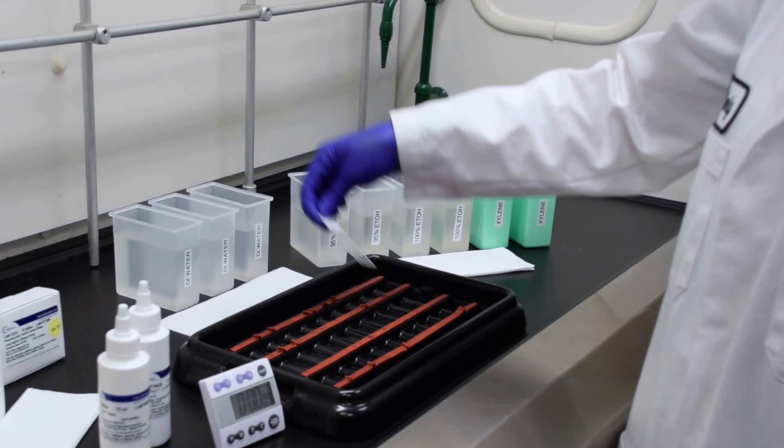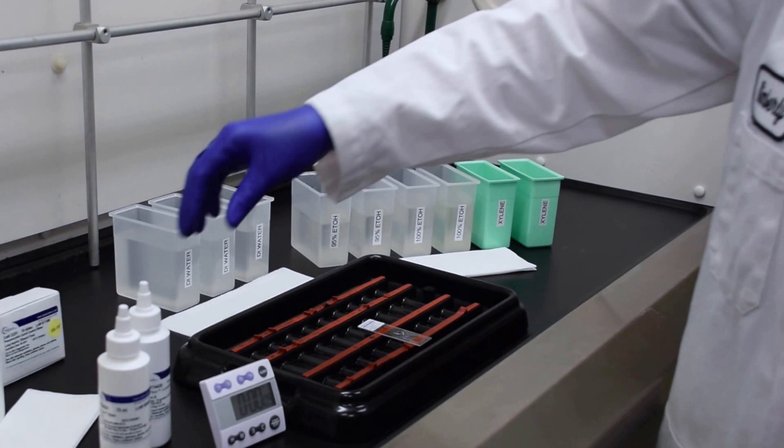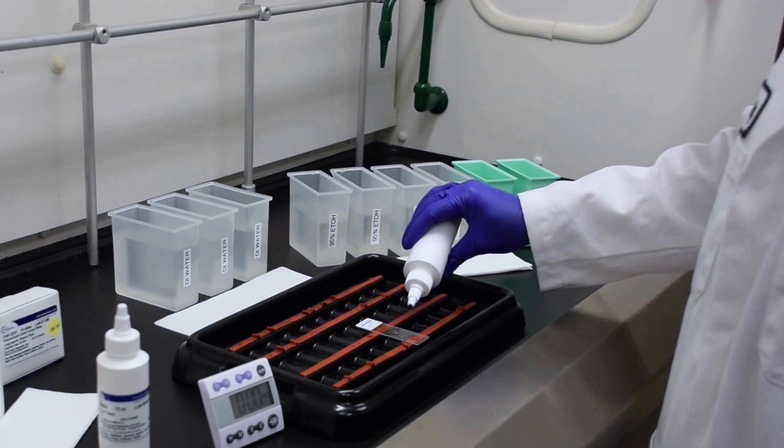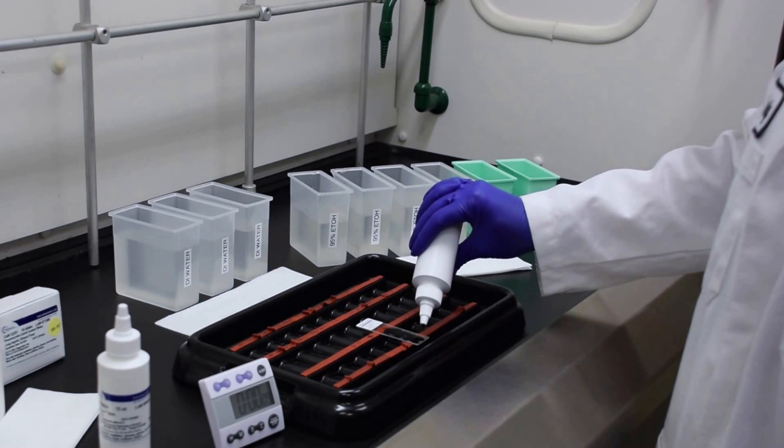Now place your slide in a horizontal position again on your staining tray and apply a few drops of solution B directly to your specimen. Again, flood the slide with the solution.